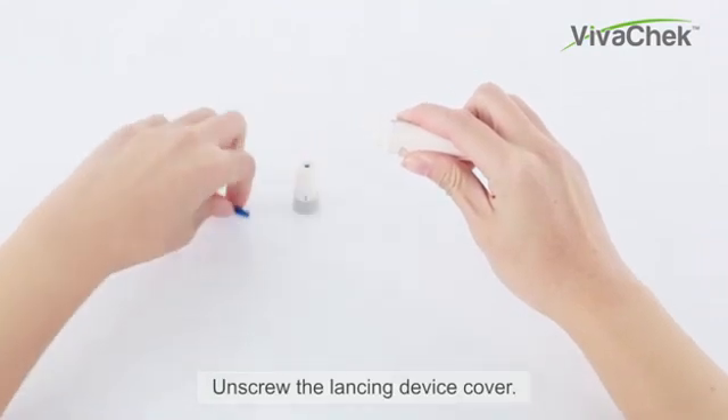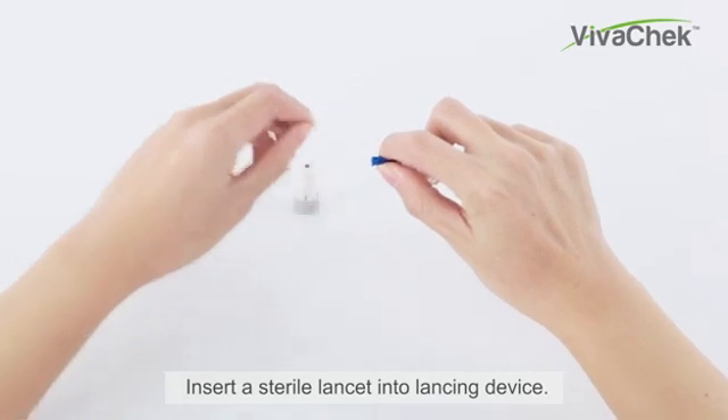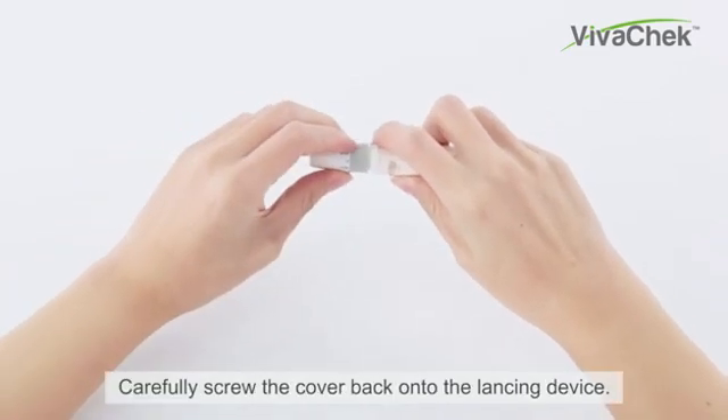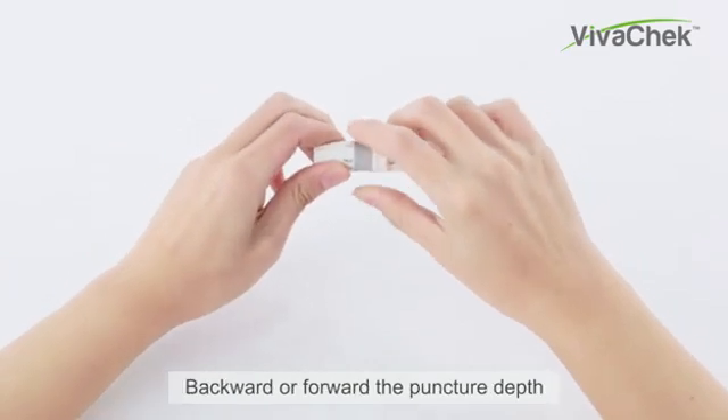Unscrew the lancing device cover. Insert a sterile lancet into the lancing device and twist the safety tab of the lancet. Carefully screw the cover back onto the lancing device, forward.